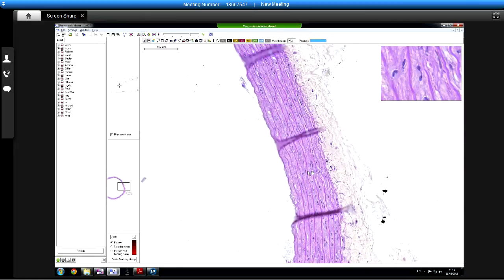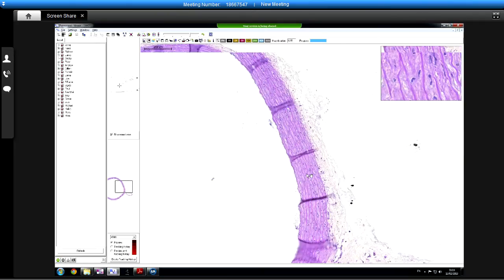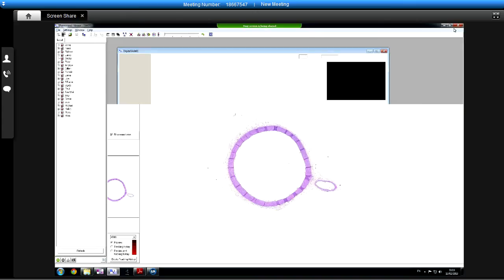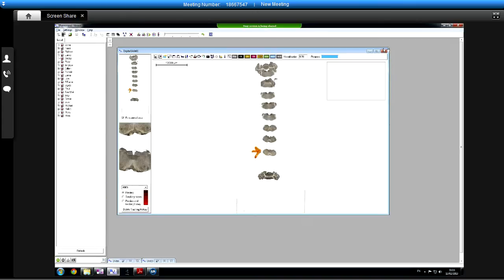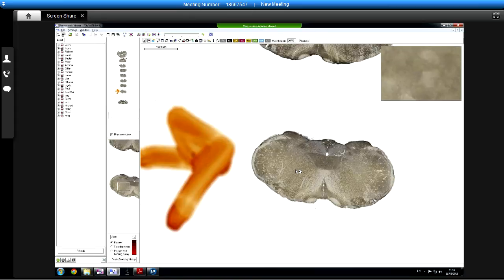And then the third one is yours, isn't it? So in here, I think we've already talked about it. We're looking at, yeah, those are actually brain sections, which are not the easiest to look at. But yeah, so these are the positives, are they?